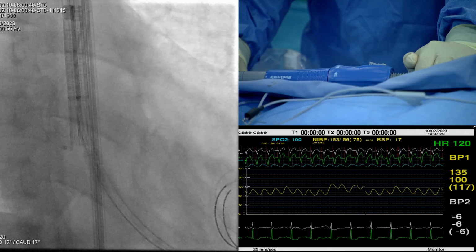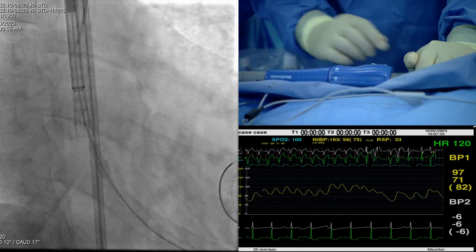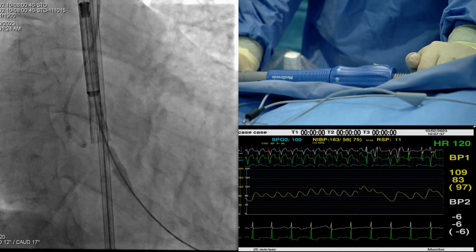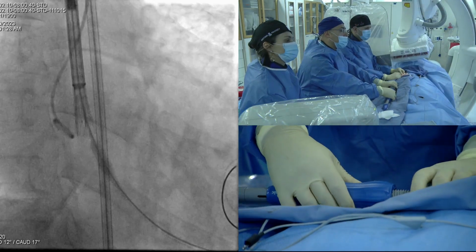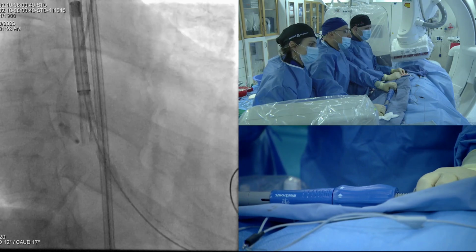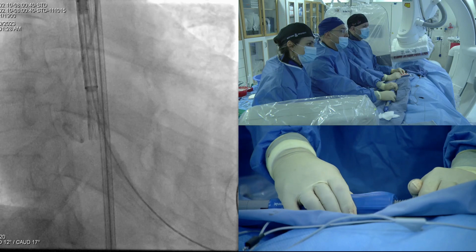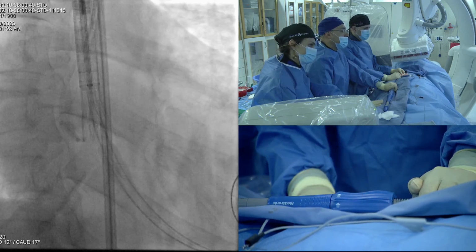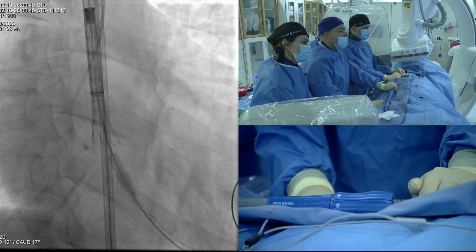Yeah. And very stable pacing throughout the procedure. Nice. It may have come up a bit. Let's do another injection. No, looks stable. It's maybe -1 or 0. Yeah. I'll give you a bit of tension. Okay, that's enough. I think it's good. So I'm doing really slow movements here and stopping even. The patient is stable. There is no need to rush.